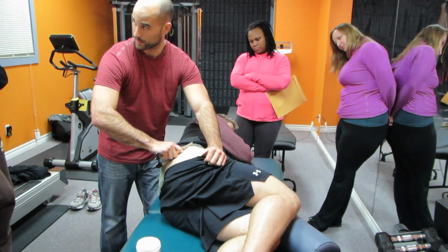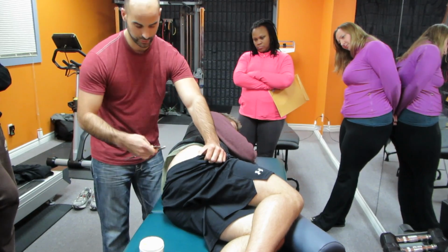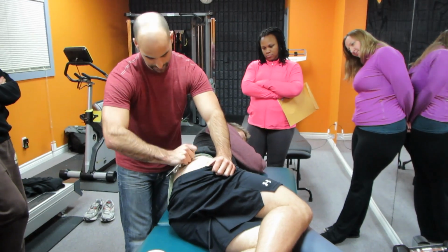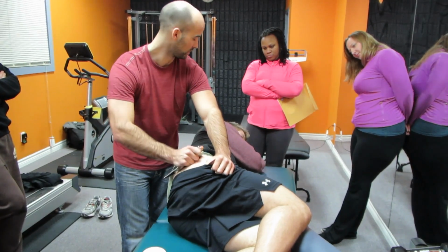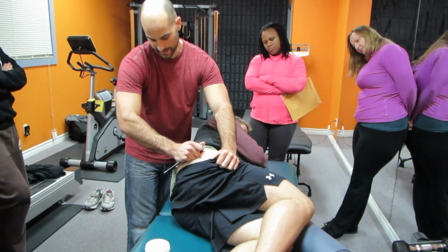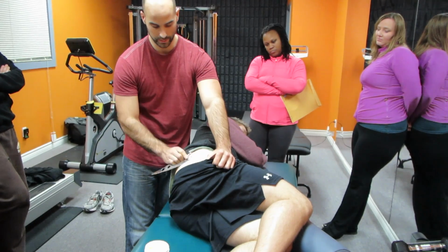Once I've treated a little bit of those superficial tissues, we can flip this guy over, and now we're going to use that 55-degree edge. I'm going to use the same amount of pressure, and he can probably tell you it feels a little bit different. But I'm using the same amount of pressure as I did with the 35-degree edge, and now we can get a little bit deeper into those other tissues, okay?